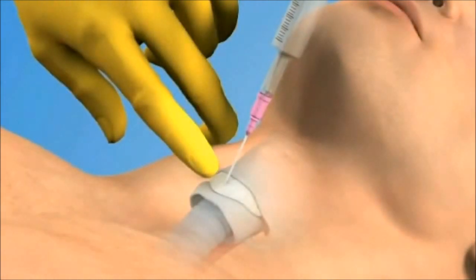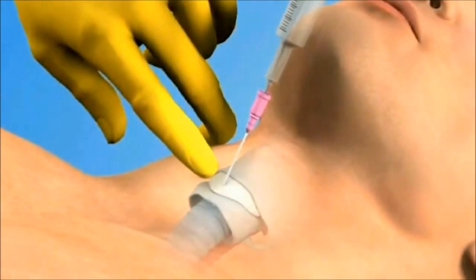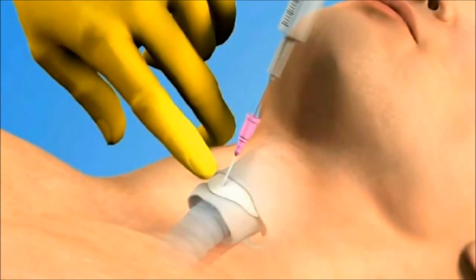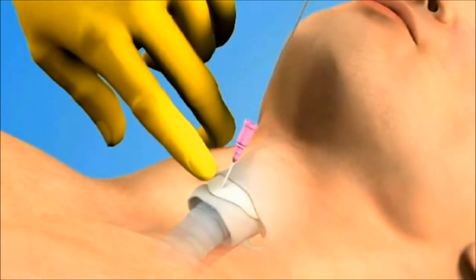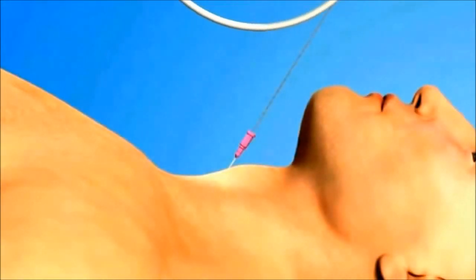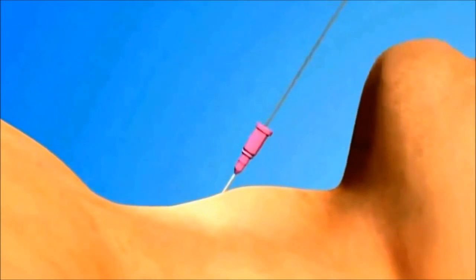Once proper needle position has been confirmed, advance the catheter over the needle and into the trachea. Next, thread the guide wire through the catheter and into the trachea.